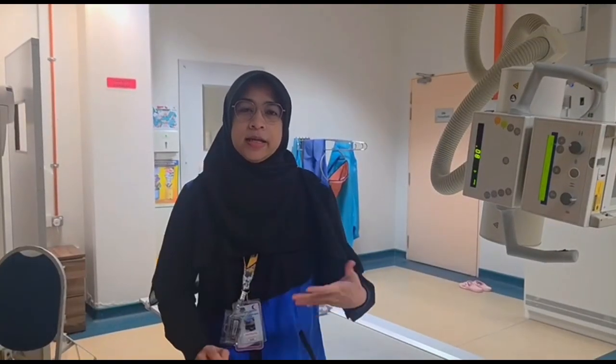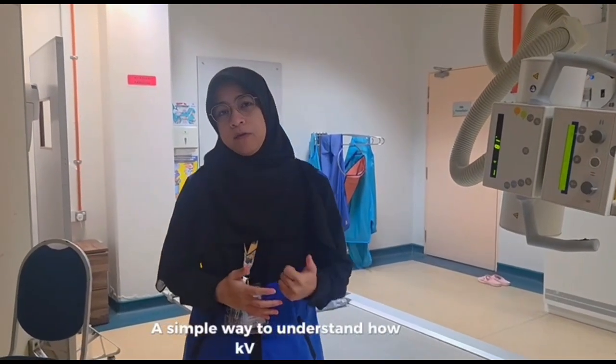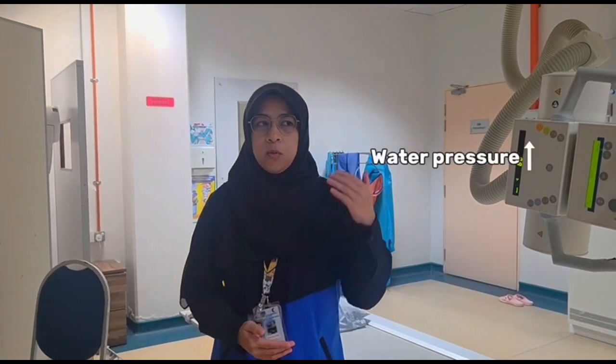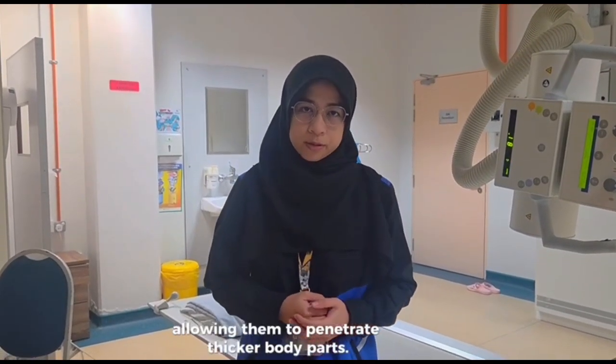KV represents the energy or strength of the X-ray beam. A simple way to understand how KV works is we can imagine the body part is like a sponge, and KV is the strength or the energy of water pressure. Okay, the sponge has different kinds of thickness. If the water pressure is low, only a few drops enter the sponge. If the water pressure is high, the water can penetrate the sponge more easily. So, in the same way, higher KV gives the X-rays more energy, allowing them to penetrate thicker body parts.